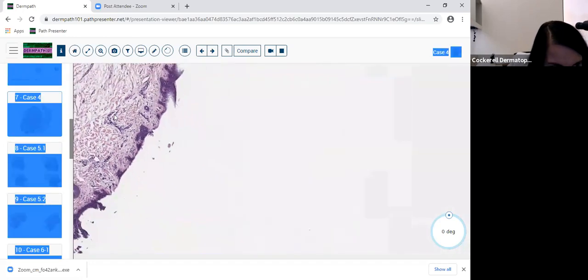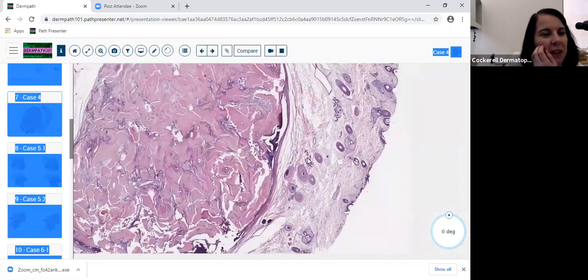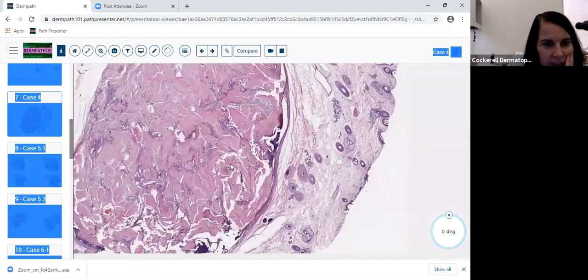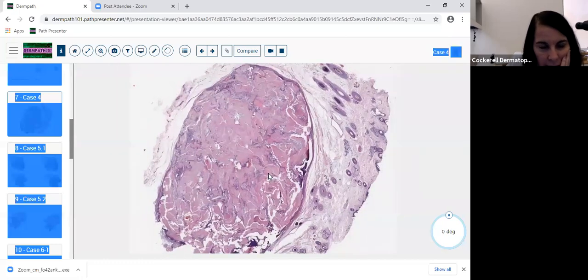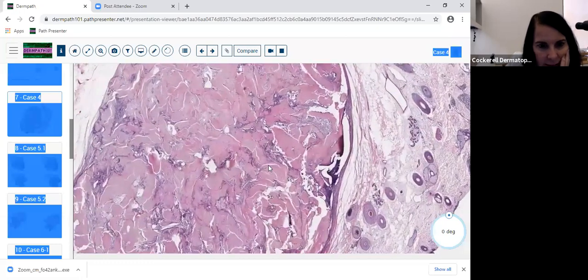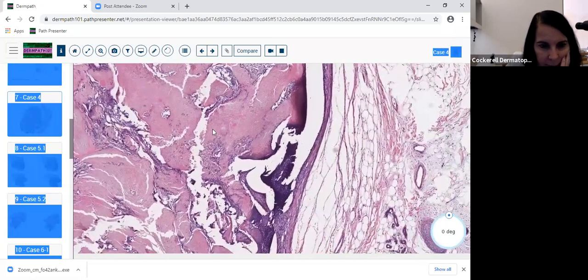So right away, because I'm looking at it, I'm thinking there's this nodule deep in the dermis. Could this be a met? Could this be a cyst? Could this be a proliferating pilar tumor or a tricholemmal cyst? But then when I go in on higher power, I start to notice there are two populations of cells.